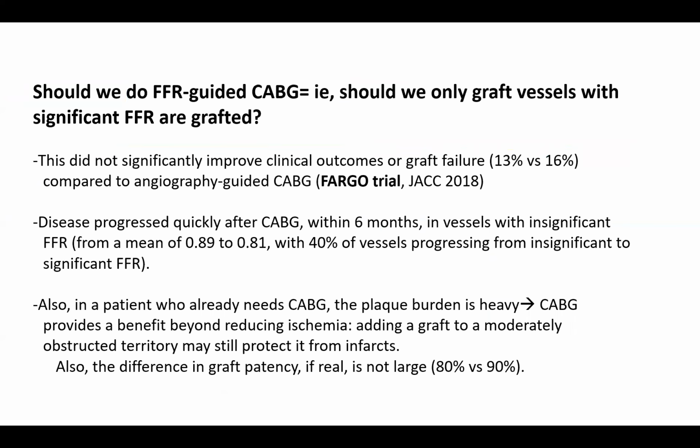The last idea here, and I disagree with some interventionists about this concept, so I do want to describe this idea. Should we do FFR-guided CABG? Meaning, should we only graft vessels with significant FFR? Here is the idea. I'm not saying whether we should use FFR to guide whether we need CABG or not. Yes, absolutely. If you have a patient with borderline left main and LAD and you want to decide whether he needs CABG or not, yes, do FFR and decide whether those lesions are significant.